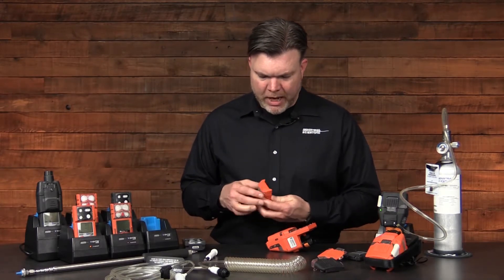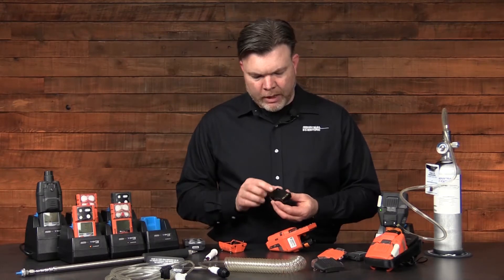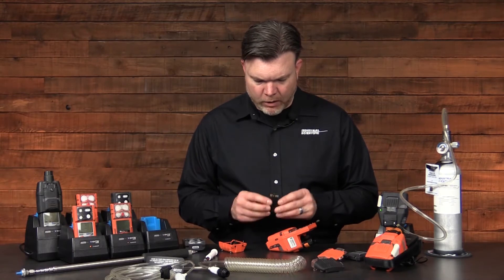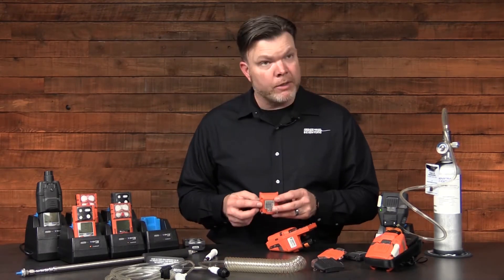The extended range battery does come out of the case. Do a complete visual inspection of the battery as well. Make sure that it's in good repair and that all of your contacts are in good condition. The case should also be in good repair.